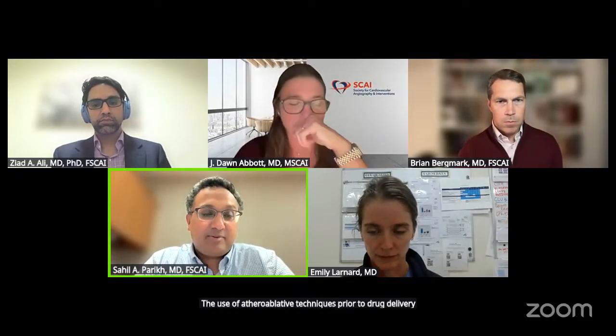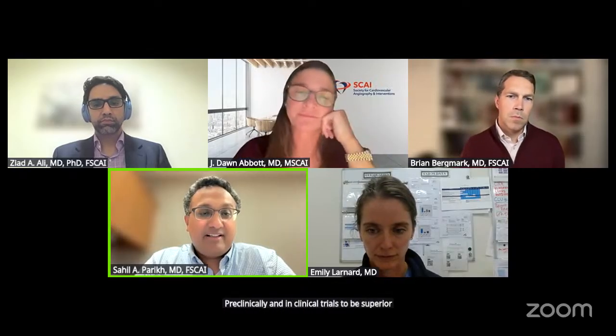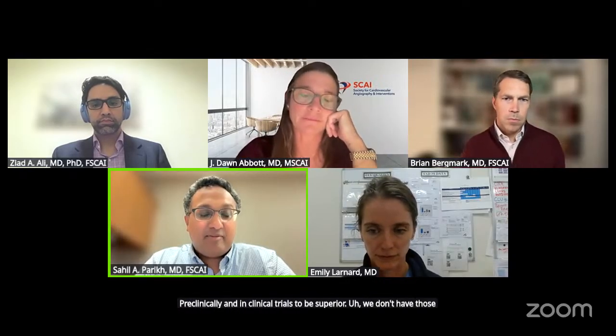I wonder, is there a preferred technique? For example, in other vascular territories, the use of atheroablative techniques prior to drug delivery has been shown both preclinically and in clinical trials to be superior. We don't have those data available for human coronaries, but I wonder where is that leading edge?